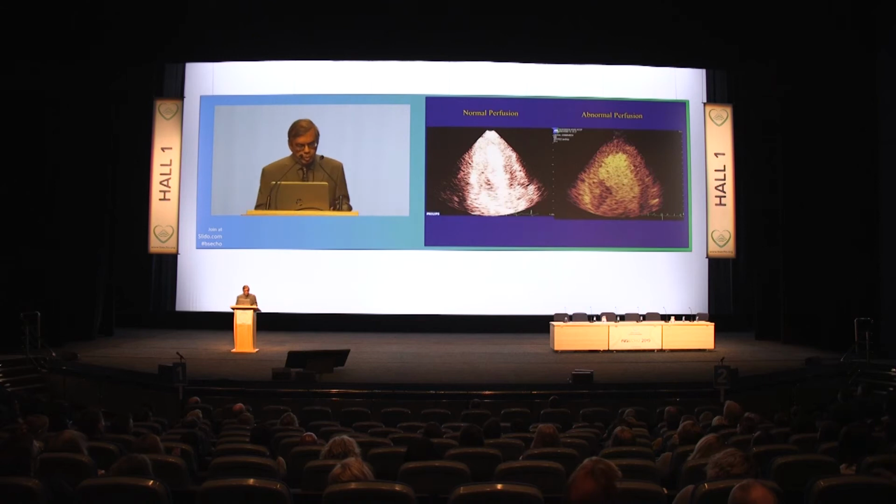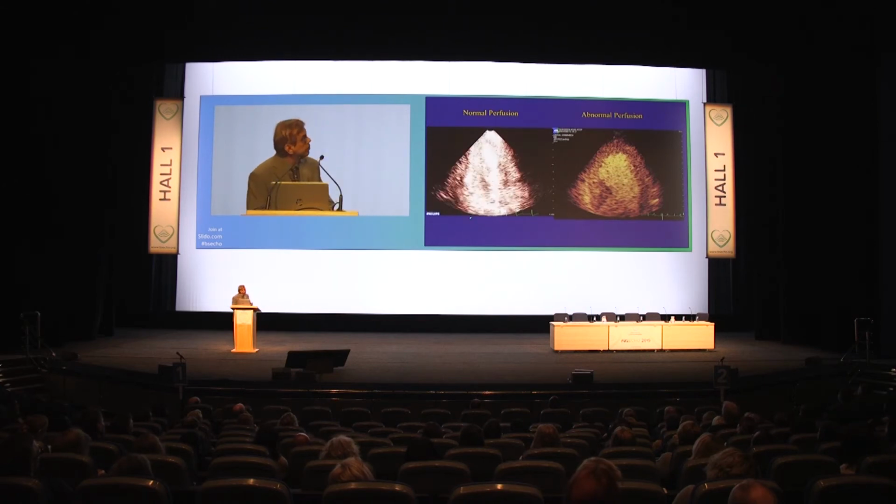So let's look at 2 examples. On the left is an example where we've given a vasodilator, and it's 60 beats per minute. You can see immediately after the flash, the epicardium to endocardium fills simultaneously. This filled in 1 second. So you're allowed 2 seconds, and it's 60 beats per minute. If the heart rate is 120 beats, then it should fill within 4 beats, right? So you convert the seconds into beats depending upon the heart rate.